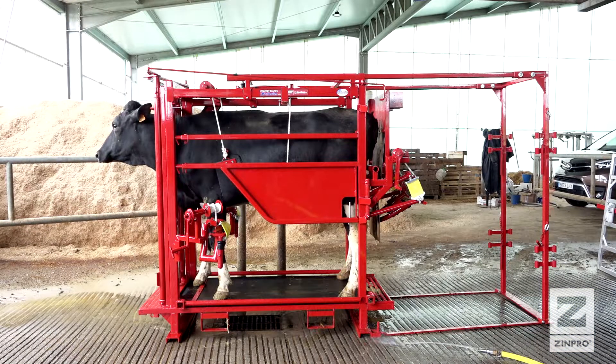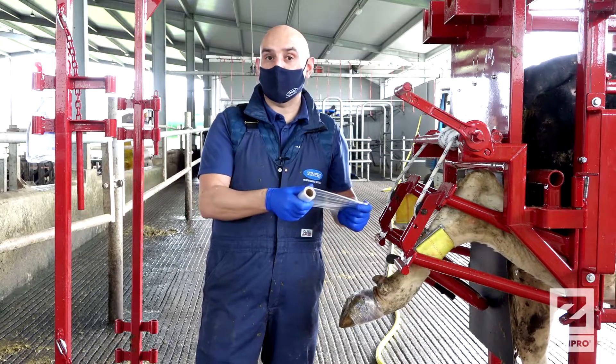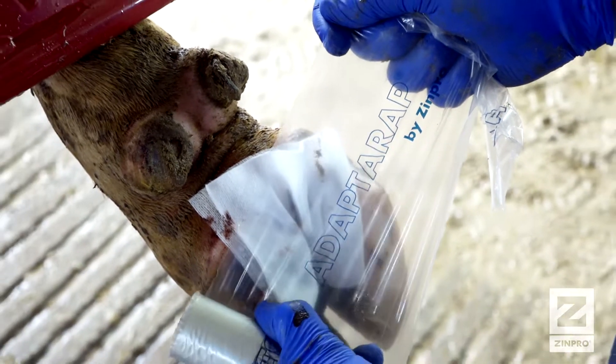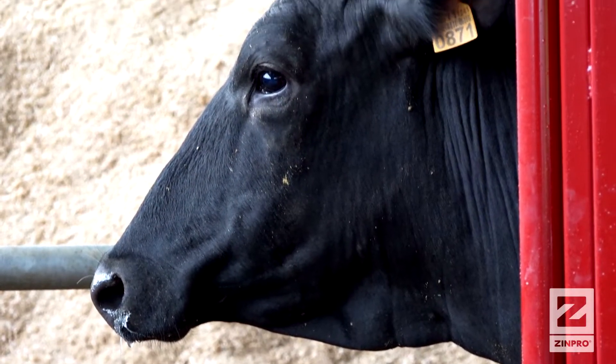One of the main advantages of this new multipolymer product is that after we apply the bandage, in a period between a few hours and two or three days, the bandage will dissolve — of course depending on the environment where the animals are.